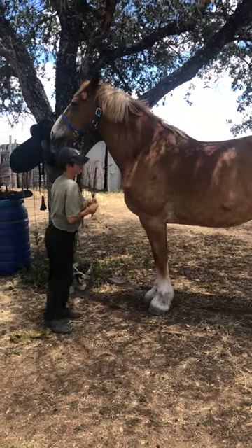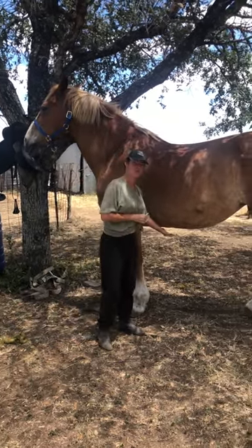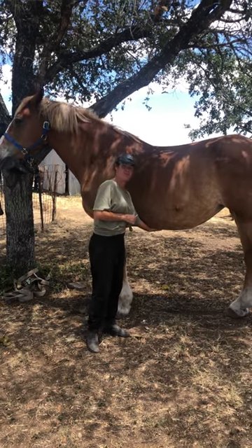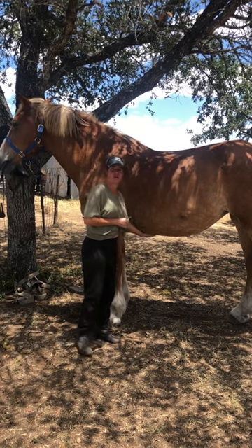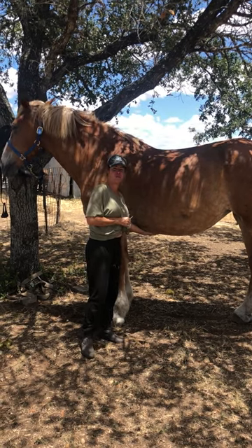When you're checking a horse's vital signs, you can bring a stethoscope down here and you can listen to their breathing. If they're breathing normally, you just count one, two, three.